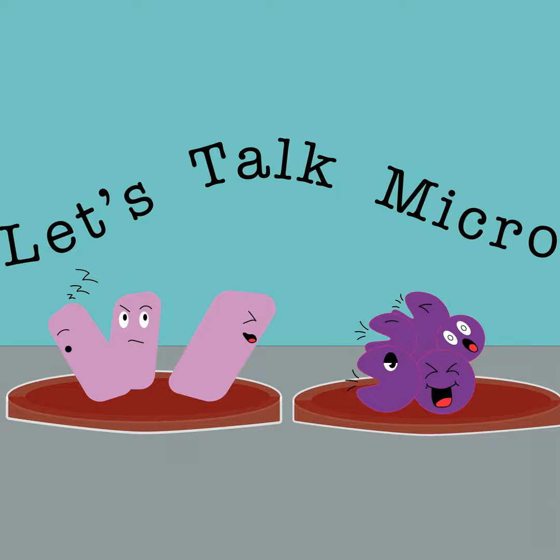But when you're learning, when you're getting started, there's so much information. This not only applies for micro, but for other areas as well. So we like to keep it simple when we're teaching or asking you on the ASCP. And then as you get to the work area, you start learning more and more. So for your indole positive, Proteus vulgaris. For your indole negative, Proteus mirabilis.